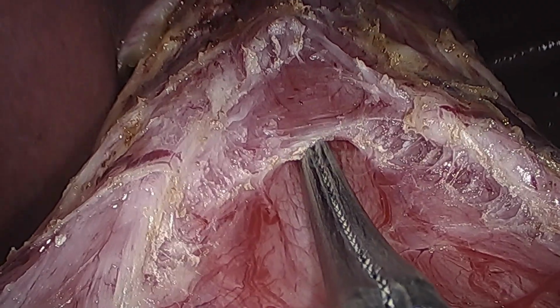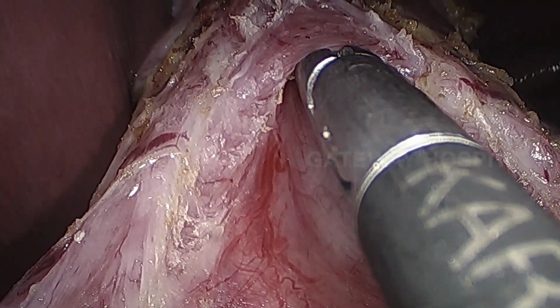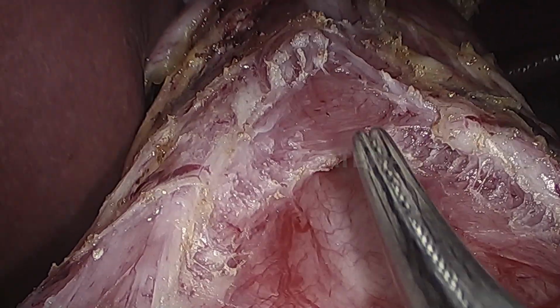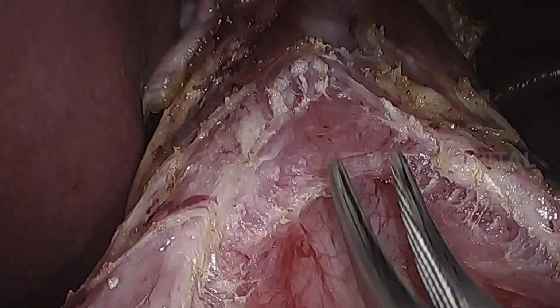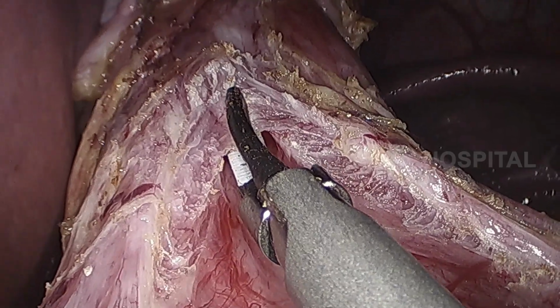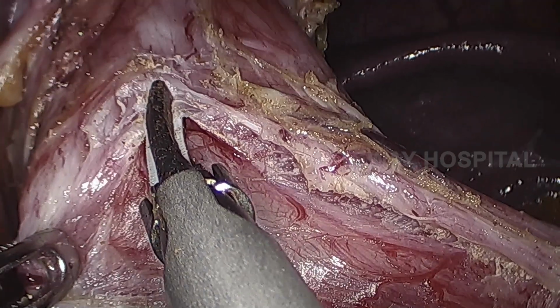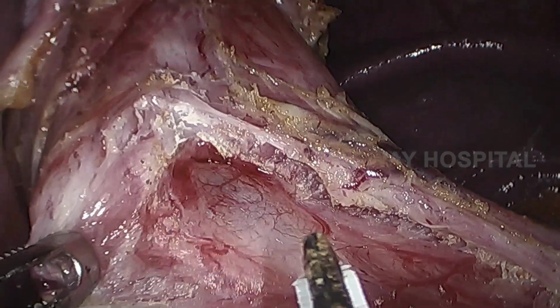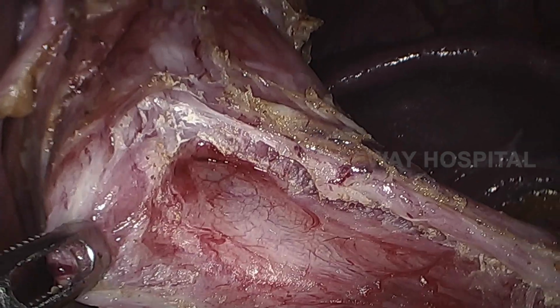Normally in esophagus which is not grossly dilated, once we take the harmonic shear, we will be able to complete the entire myotomy without changing this instrument. But here this is a very grossly dilated esophagus. You can appreciate the very thin mucosa.